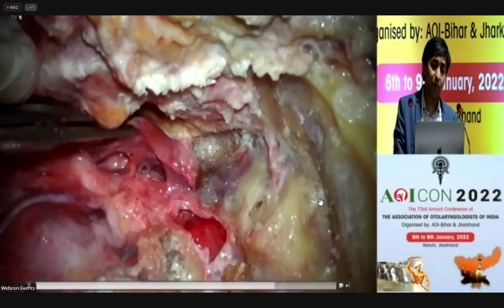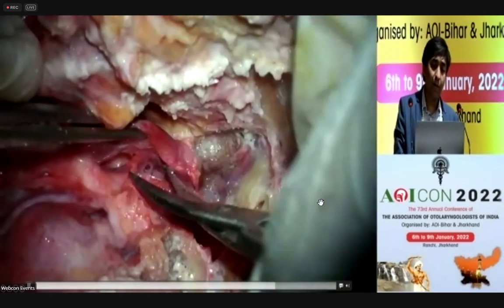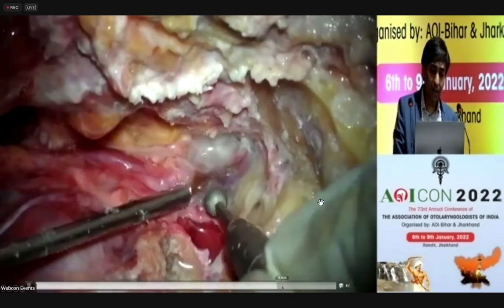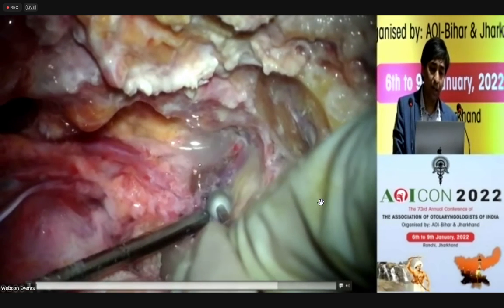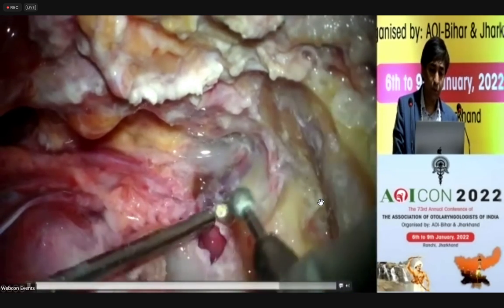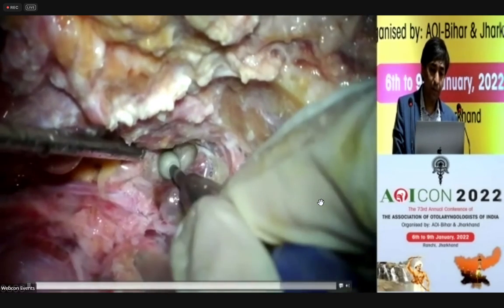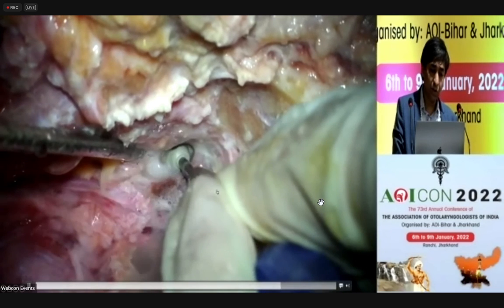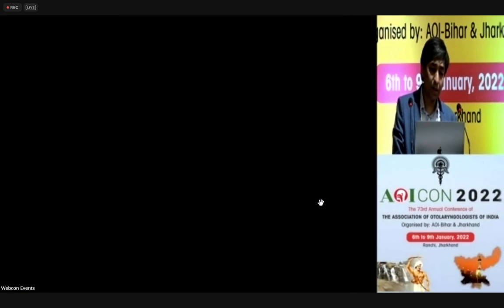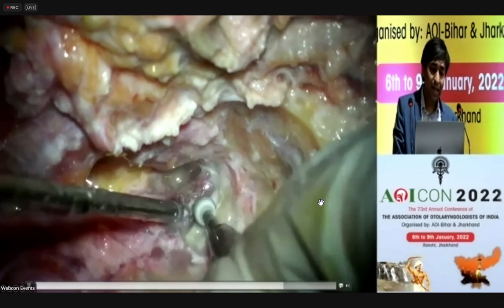This also would be infiltrated by tumor, but you need to develop a plane here and not be scared of that fibrous cuff and leave behind tumor. So you can drill anterior to the carotid, go all the way up into the foramen lacerum, posterior to the carotid, all the way into the petrous apex and clivus. We can drill, follow the tumor, no problems whatsoever, as long as you have control of the carotid in these areas.